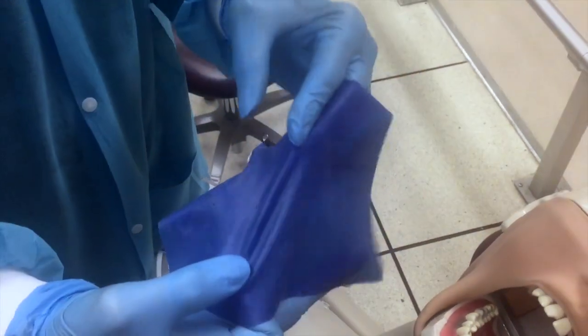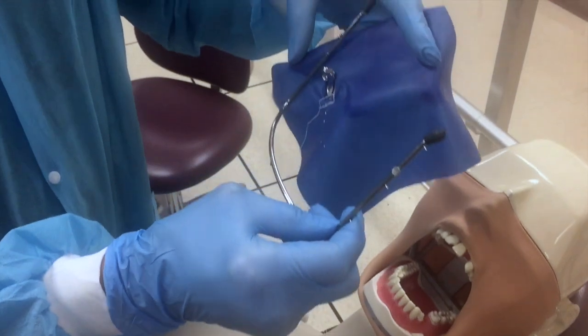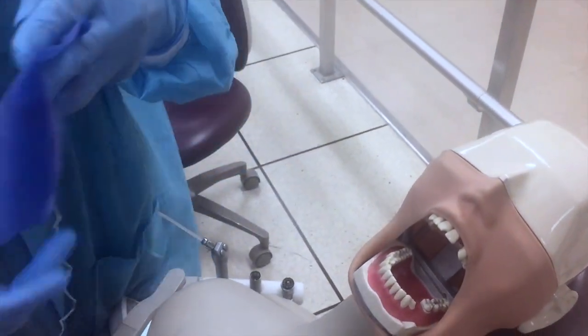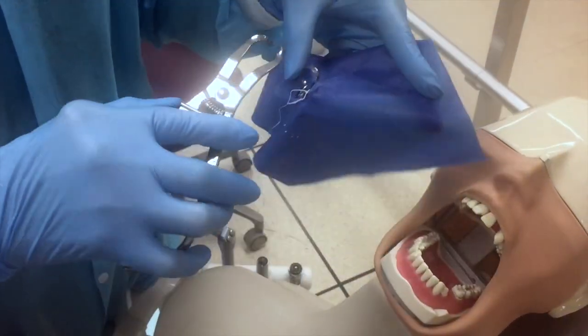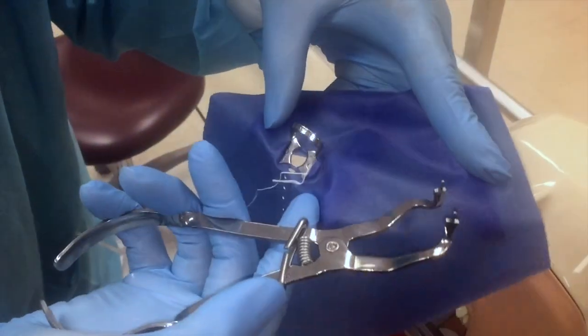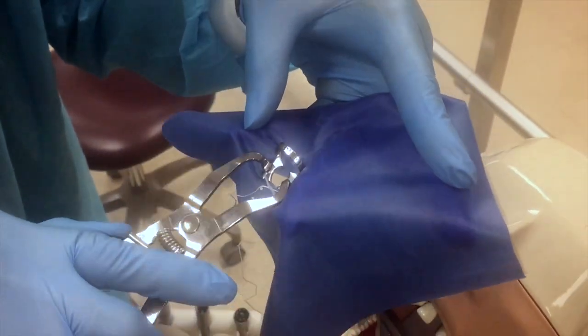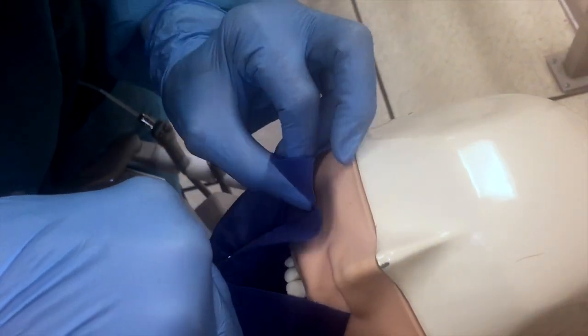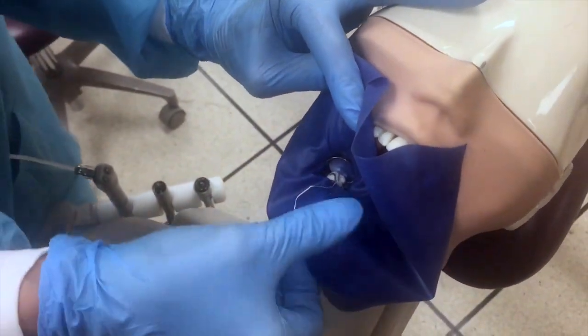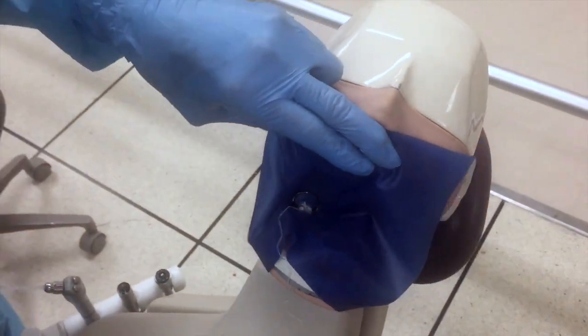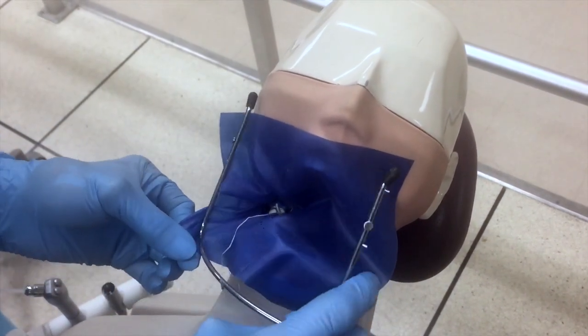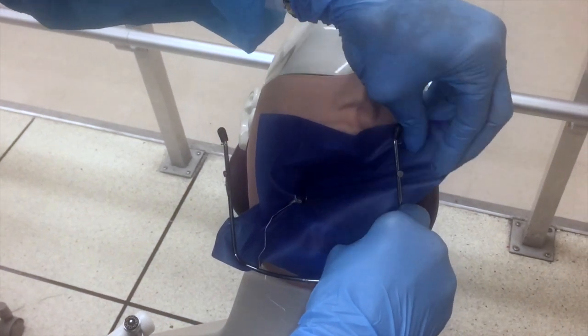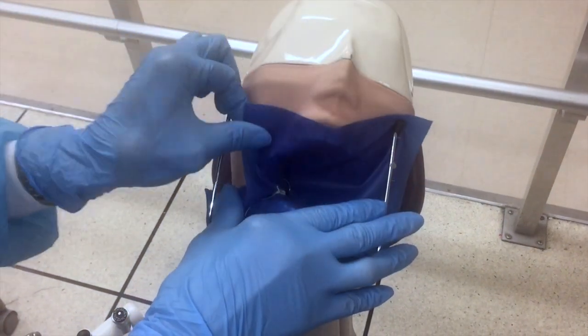I don't usually do this, but the next step, if you'd like, you can attach your rubber dam to the frame. I'm more comfortable doing it this way, which is the way I was taught. We're going to take our forceps and put the little prongs into the retainer. Squeeze the handles and let's go over the tooth lingually and then roll to the buccal. Now, let's put the frame on. If you're working by yourself, this can be awkward, but I like to spear one end of the dam, then go diagonally and spear the other end.